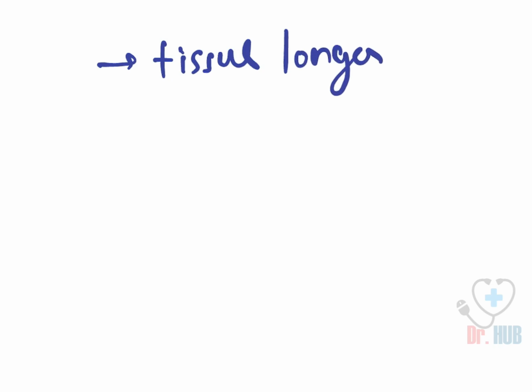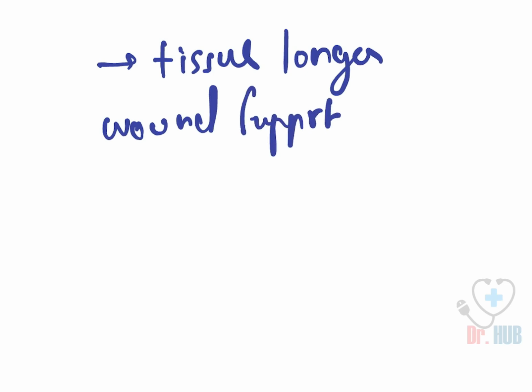And where is it used? It is used in tissue where longer wound support is required.